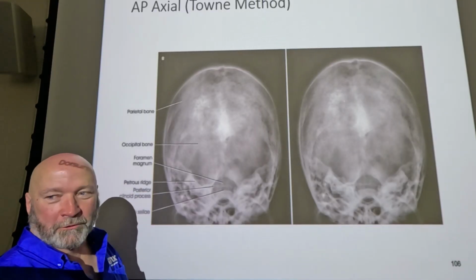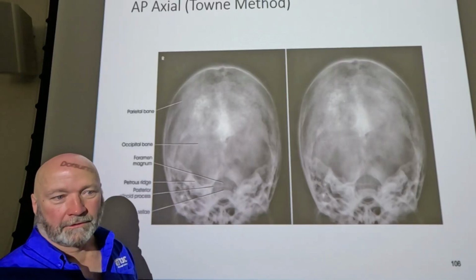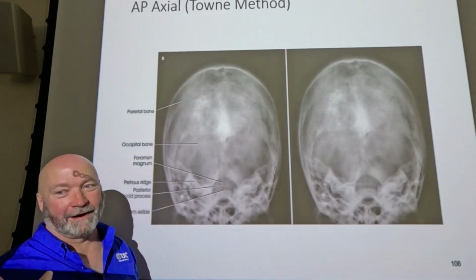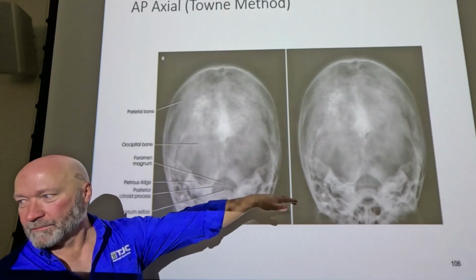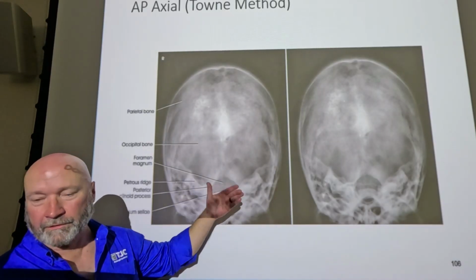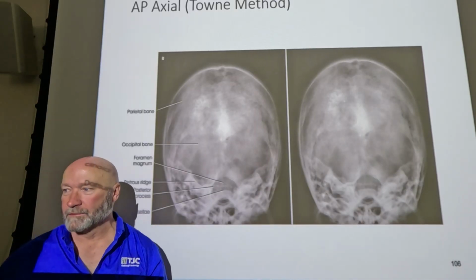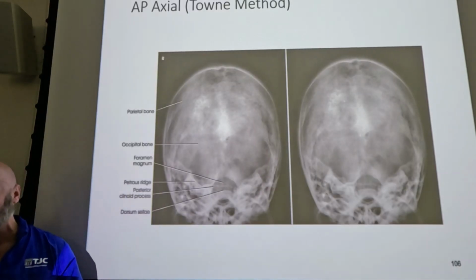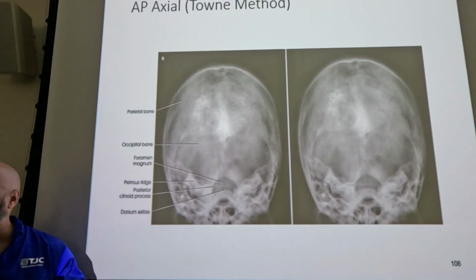And nobody would know who Haas is. So what Haas is going to do is require a 25-degree cephalic angulation. That gives us this same thing, but it's a reverse of the Towne. I think that's even a question on the test as well: the reverse of the Towne is the Haas. Exactly? No. Effectively? Yes.